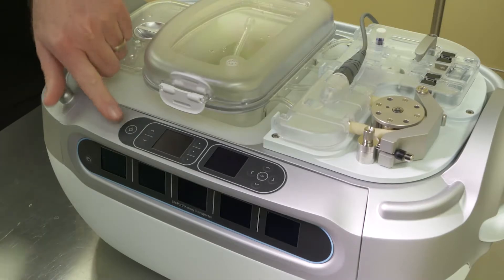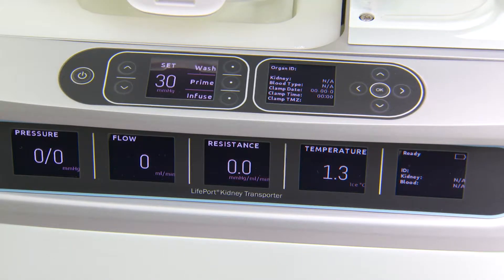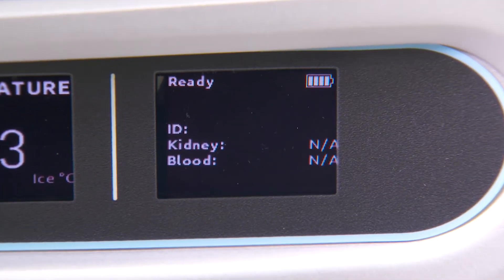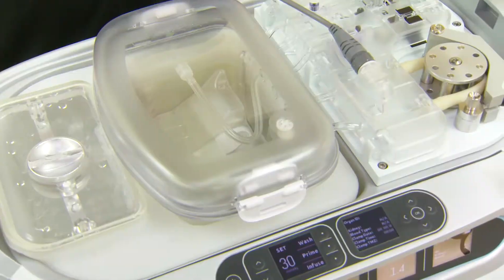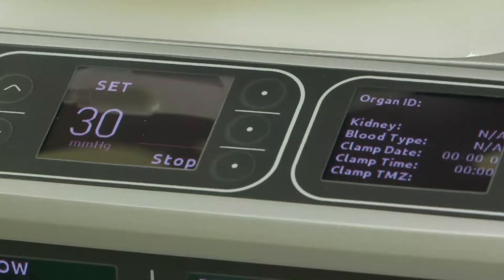At this time, the unit can be powered on, and it will go through a series of self-checks. Place the unit in wash mode to start the fluid flow into the perfusion circuit.